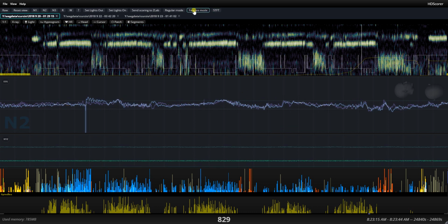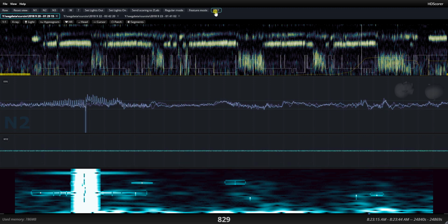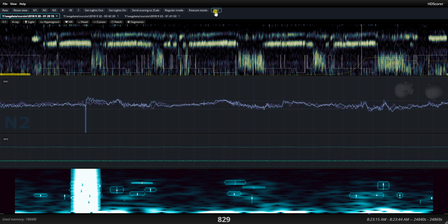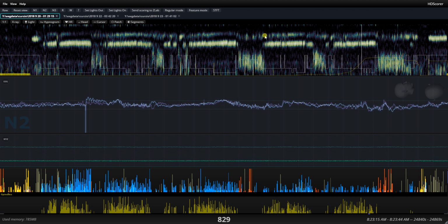I can jump to the short Fourier transform to see what that is. That looks like, I don't know, either electrical interference or something like that. So that's not biological in nature. We don't have to care about that.